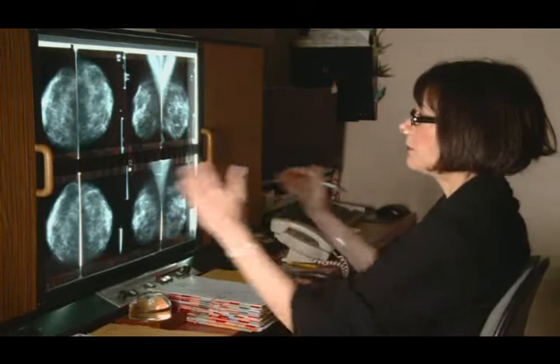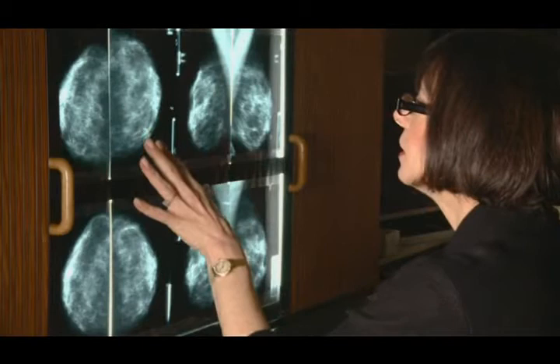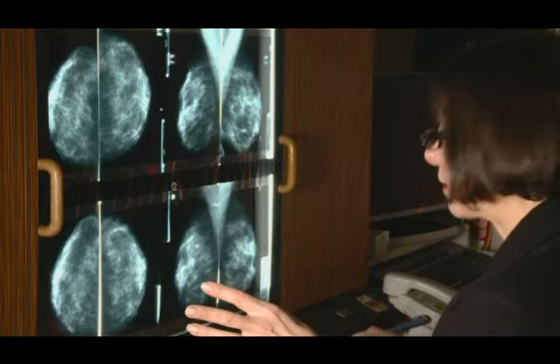Right away my eye is drawn to a spot over here that I'm going to come back to in a second. So then we get up close and we've got to classify how dense the breast is — how much fat, how much dense tissue. With this, I would say it's between 25 and 50 percent, so I'm going to mark that on the form.